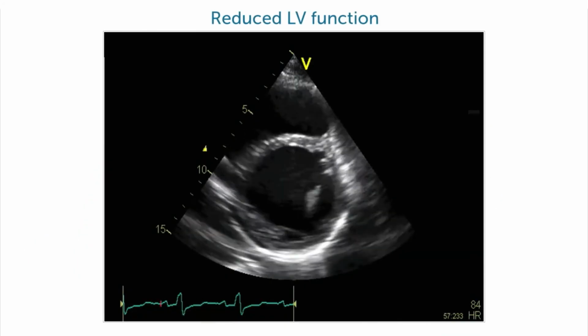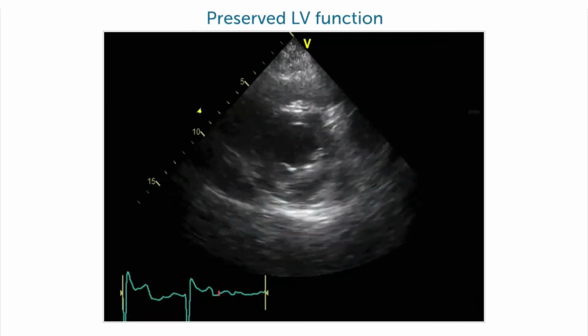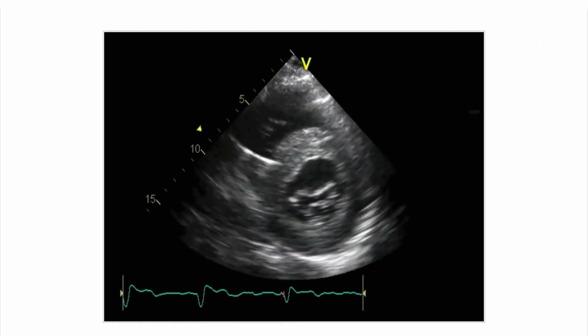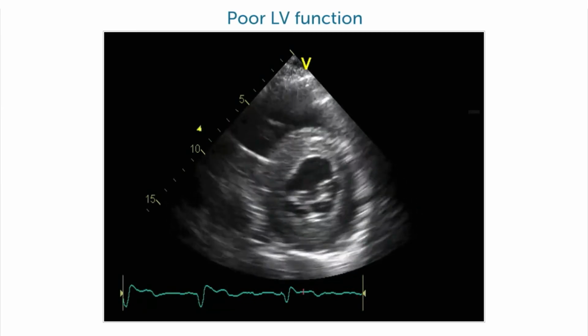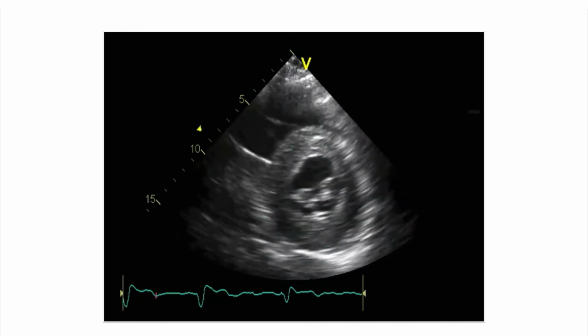And if you look just for comparison purposes, this is a normal ventricle. Right. You see, these are the things that we taught you already in the starter kit. I'm sure you all recognize the function already from the short axis view, and you probably also know that this patient has poor left ventricle function. See, we have, again, a very thick interventricular septum and poor left ventricle function.